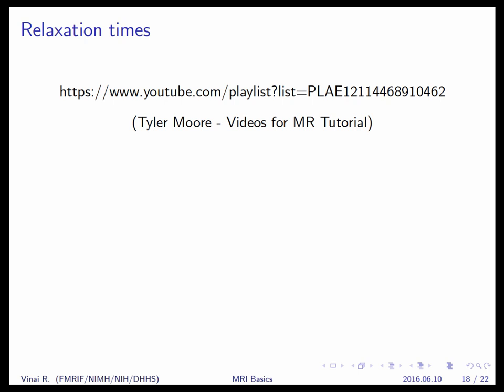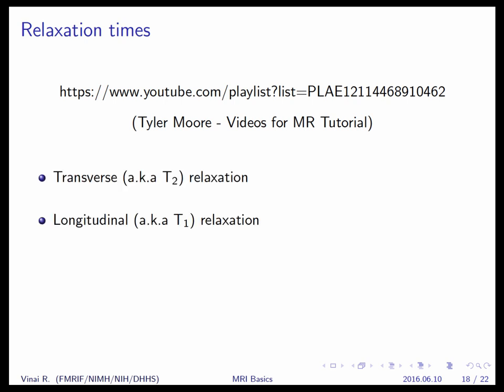So again, I have a couple of videos from the same site that I showed before. Now, remember we're talking about putting a sample of protons in a magnetic field and then exciting them, perturbing them with an RF field. But then naturally what happens in a system like this is they want to go back to their equilibrium state, right? I mean, we never want to be excited the whole time. Well, at least I'm not that young anymore. But you always need to go back to some kind of rest equilibrium state. And it's the same with these microscopic species.